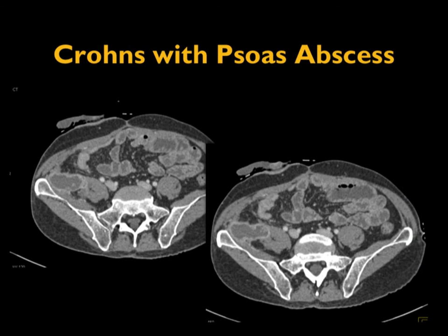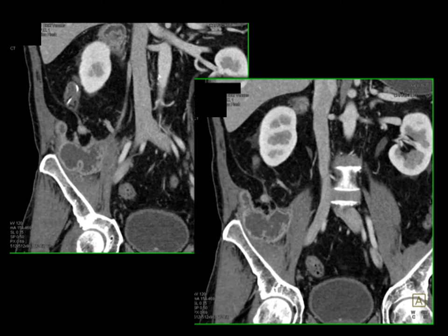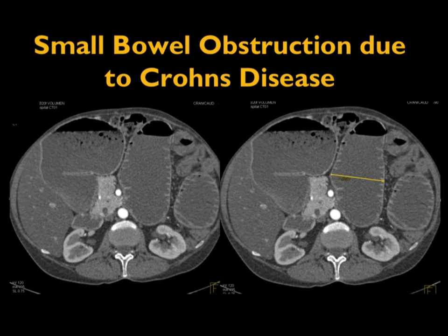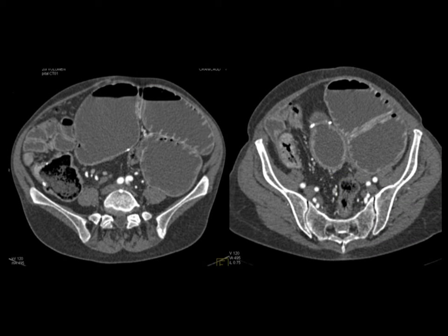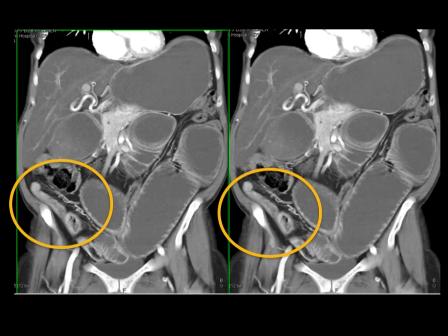When you have complications, you can have psoas abscesses with rim enhancement, nicely shown on the coronal view. Whether you're going to manage it conservatively with percutaneous drainage versus surgery, it's important to know the extent of the process. Here's another patient with Crohn's disease — dilated small bowel, obvious transition point in the right lower quadrant. Every day of the week I would say this is an inflammatory stricture — but when the patient was operated on, this turned out to be a carcinoma arising within a loop of Crohn's disease. You're not always going to be right, but the transition point and its cause are easy to show.